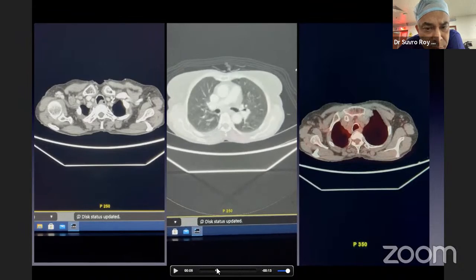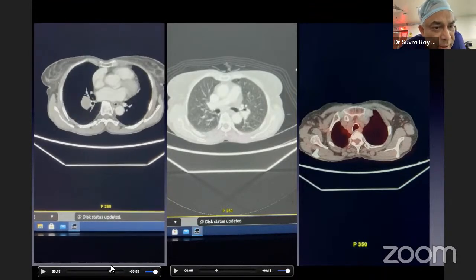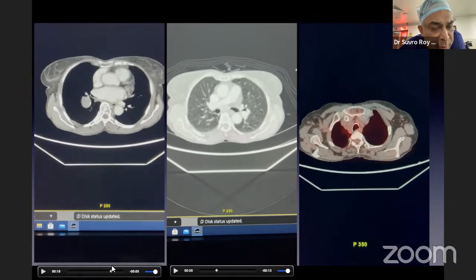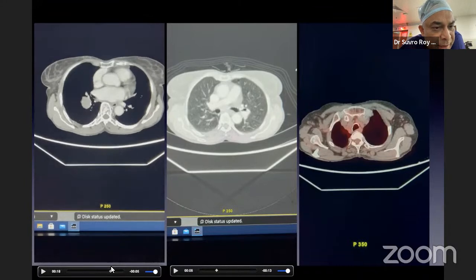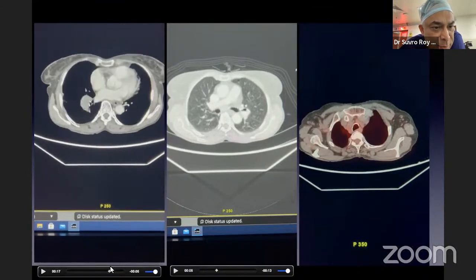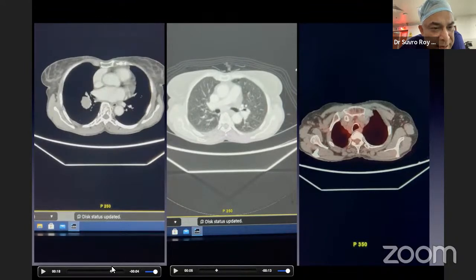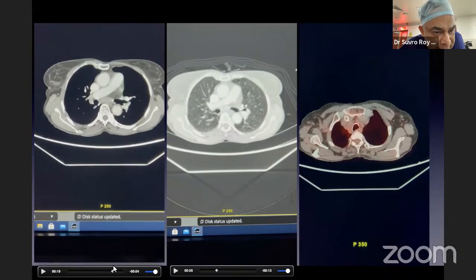And we talked about, let's just have a look whether the subcarinal node is involved or not. So in terms of radiation planning, in this particular case, I think doing a boundary to this tumor is pretty easy, right? For you guys, the tumor is quite well seen. It is quite well defined. The boundary is quite clear. And there is no immediately subjacent obstructive atelectasis that is adherent to the mass itself.